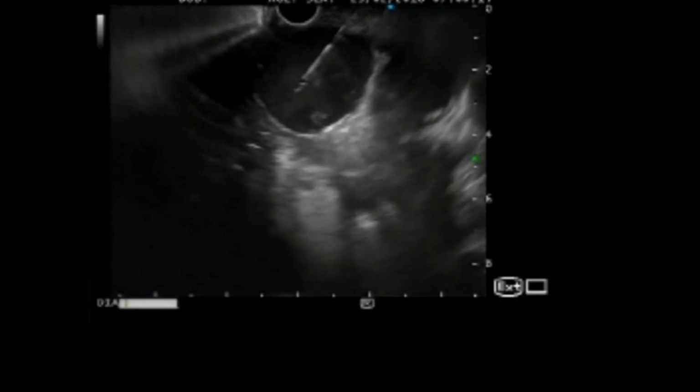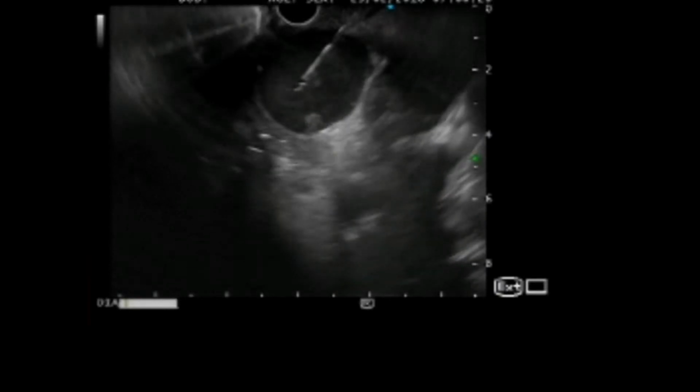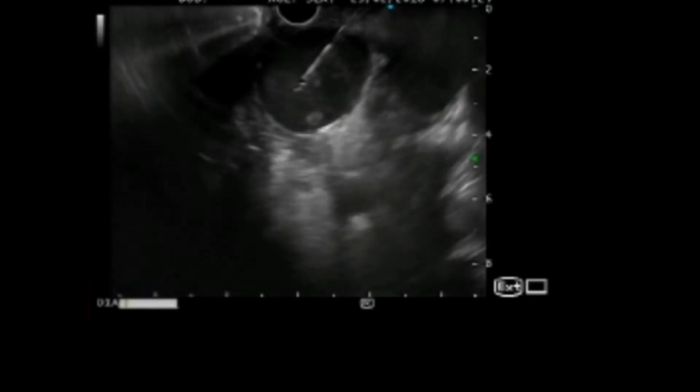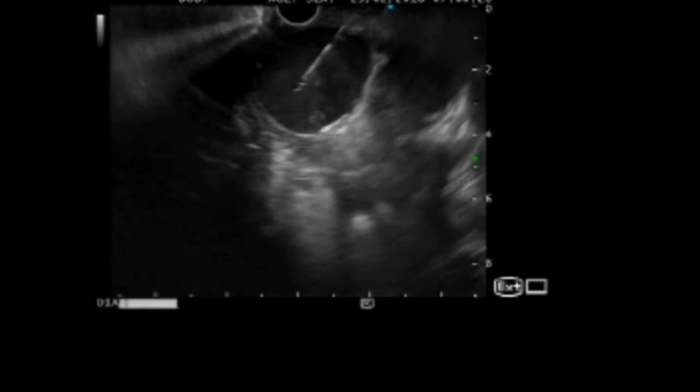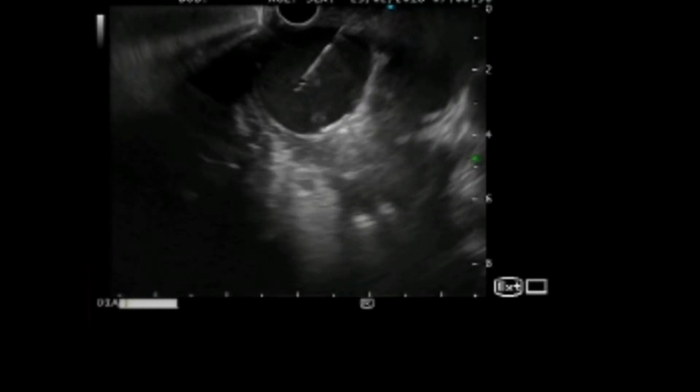We insert a lock loop hub. The coil is introduced into the FNA needle. You advance the coil into the FNA needle, remove the stylet and introducer, and reintroduce the stylet to advance the coil, so you can deploy the coil easily. The procedure should be done under guidance and with patience.